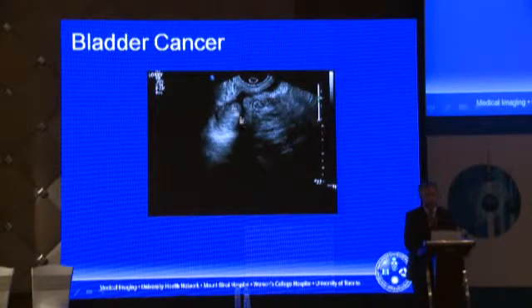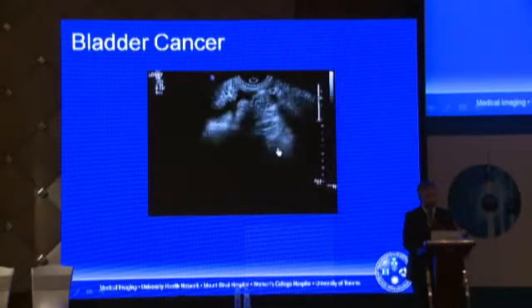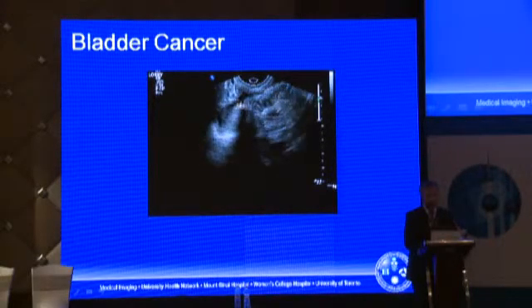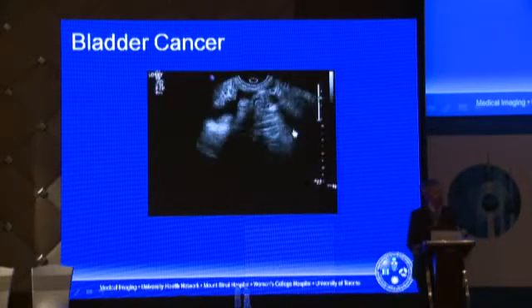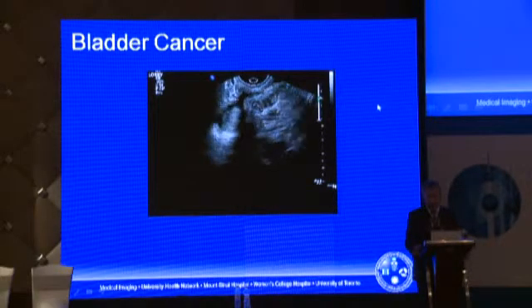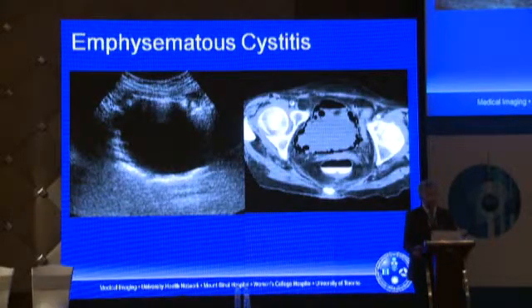When you're looking with the internal scan, it's also an excellent way to look at the urinary bladder. This patient came, there was a history of hematuria, and here we see this large mass in the bladder, and the question, of course, arises, is that simply blood clot, or is it tumor? And often with ultrasound, we use color Doppler, and we see some color in that mass, but that could be artifact. So always prove flow with spectral Doppler. And here we see arterial flow in that mass, proving that it's a polypoid bladder mass, probably transitional cell cancer.